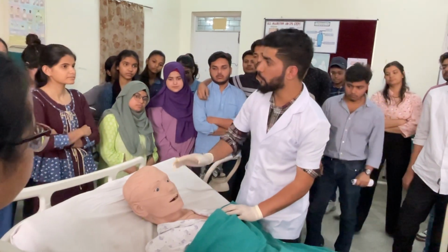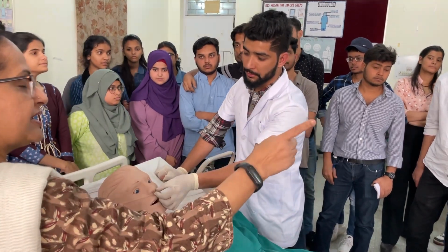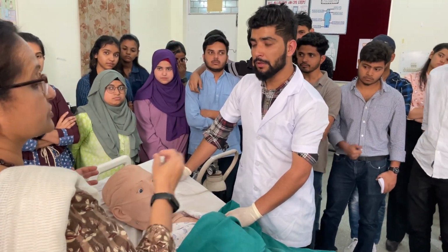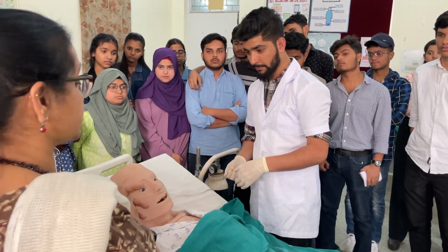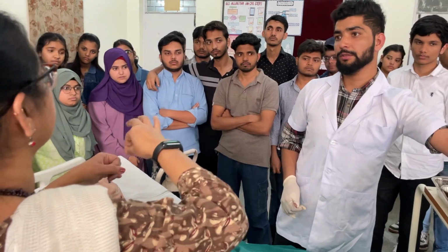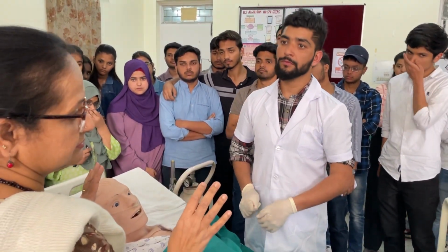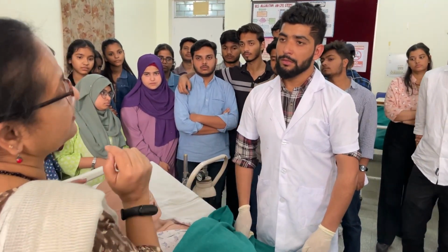After providing oxygen therapy, we have to maintain a constant oxygen concentration. And one more thing, before putting this, you have to see the patient's nostrils also. If they are clogged with thick tenacious mucus, you have to use saline. Normally, this swab stick has to be dipped in normal saline to clean it. Normal saline will help bring out all the dry crust from the nose, because if you put the prongs in with the crust, the oxygen will not pass properly.